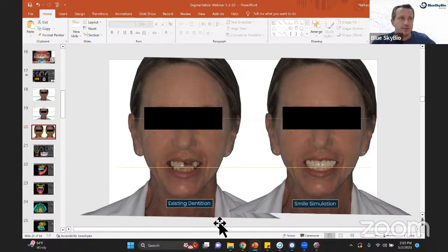Okay, I'll just comment regarding gray face. I think one of the things that they excel at is the alignment of the face scan to the CT, and they could transfer that to BlueSkyPlan, and then of course you could align the models to that. So then I think you'll get everything aligned very accurately. Also with the new updates in ortho to segment the teeth as well, so it combines everything very nicely together. So yeah, definitely everyone should be a bit cautious with that, but I think technology is improving, that it's getting better and better.